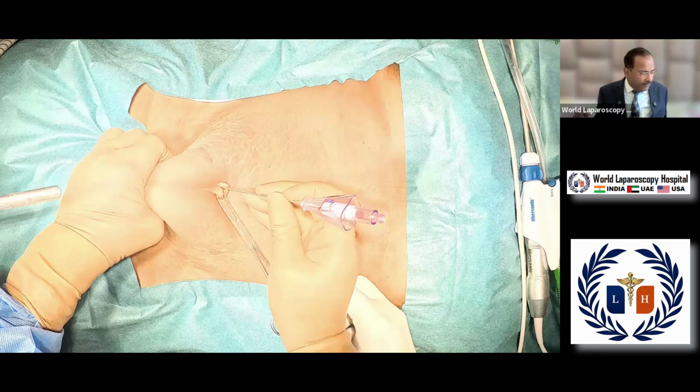Because I am perpendicular to the abdominal wall. So when you go there, you are perpendicular to the abdominal wall, and this is one click and this is second click. You will get two clicks. Hold it like a dart, go towards the anus. That will be 45 degrees from the body of the patient.